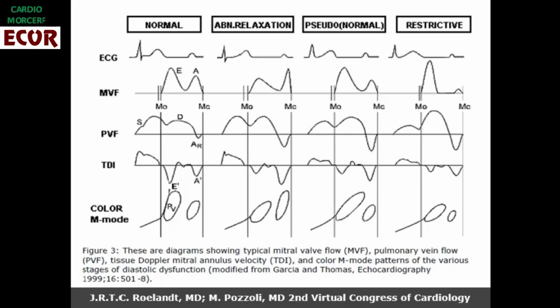The decrease of the X wave should be related to the increased pressure inside the left atrium, as well as the associated systolic dysfunction of the left ventricle and diminishing piston-like effect of the left atrial floor.